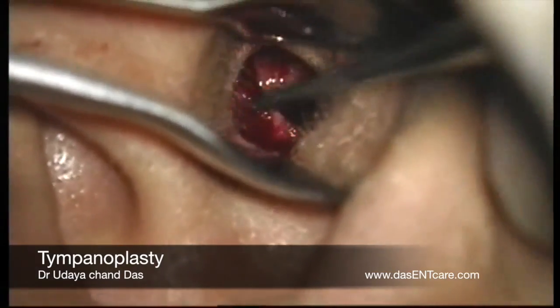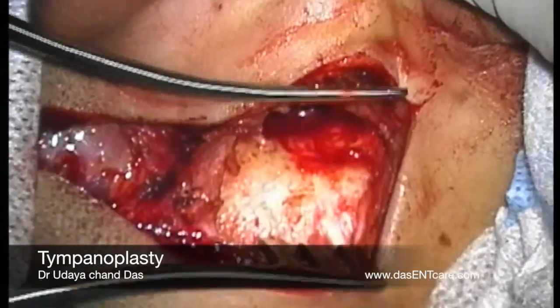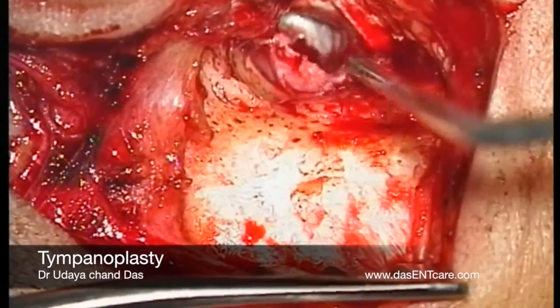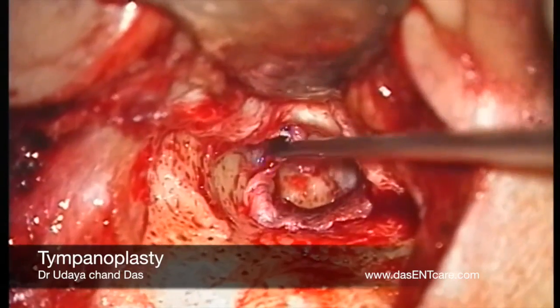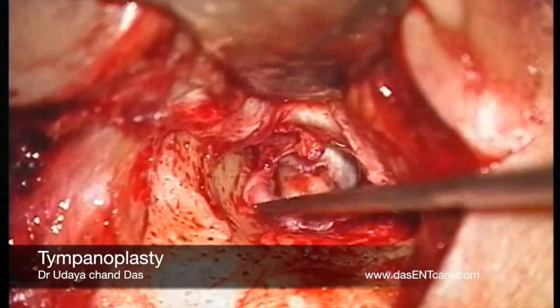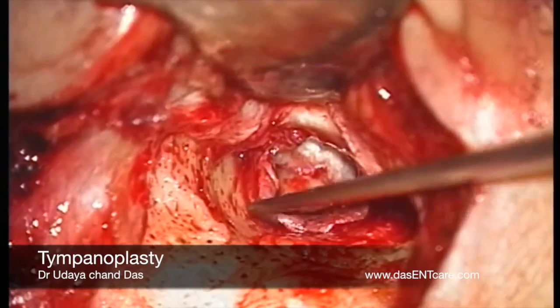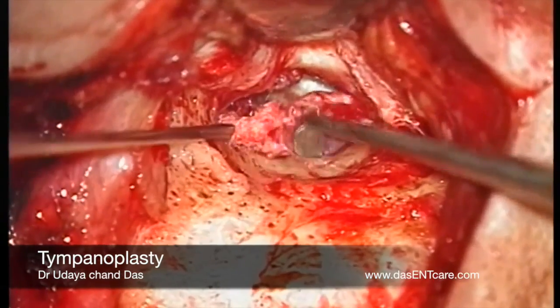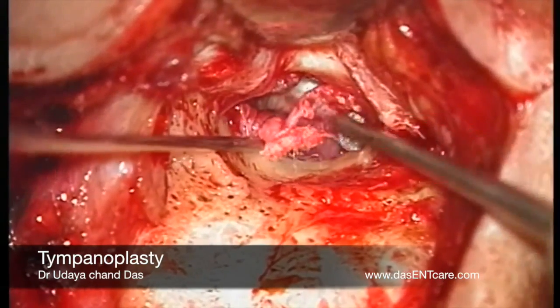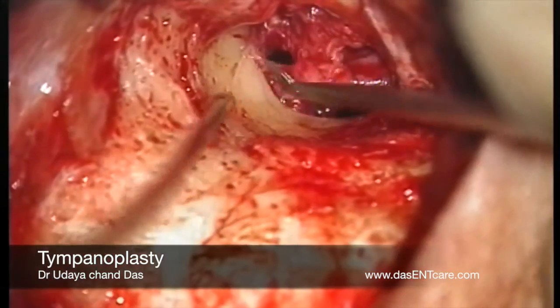This flap is gently elevated from the bone. Then through a post-auricular incision, a temporalis fascia graft is harvested and the bony canal is opened. You can see the flaps here. Now this tympanomeatal flap is extended towards the superior aspect to expose the malleus, and the tympanomeatal flap elevation is carried downwards to encompass the whole of the eardrum except an attachment anteriorly.